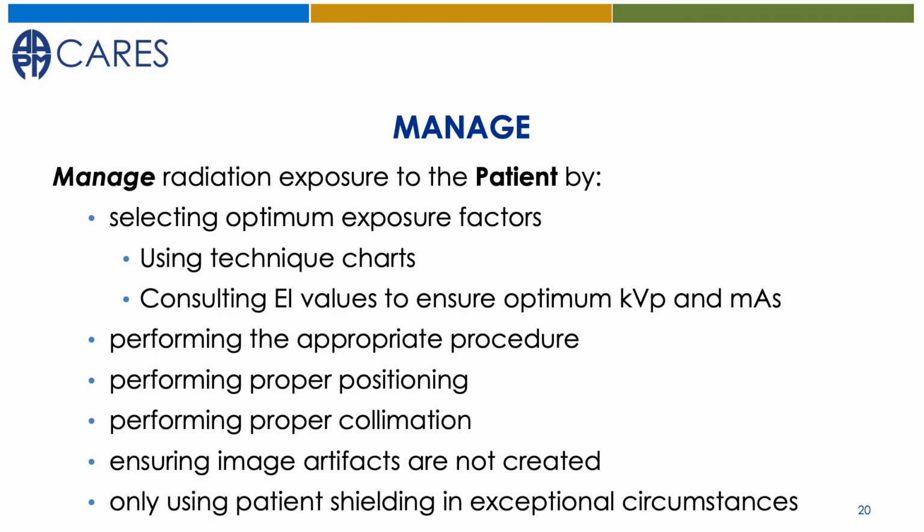shielding in exceptional circumstances. In most situations, it is appropriate for the radiographer to explain why shielding is not recommended. However, if the patient or caregiver continues to insist that shielding be used, shields may be used at the discretion of the radiographer. While we propose some general rules for discontinuation of the use of gonadal or fetal shielding during pelvic and abdominal imaging, it is important to recognize that there will still be situations that require professional judgment based on individual patient circumstances.